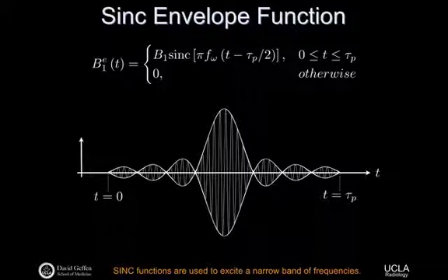We'll learn later there's lots of details that go into RF pulse design. Actually, we won't learn later because it's an entire course to talk about how to design the envelope functions themselves. We'll cover it a little bit in this class, but not too much. But this is a classic RF pulse. And so what you see here is an envelope function that looks like a sinc, meaning it has some oscillation, that's the low frequency oscillation.